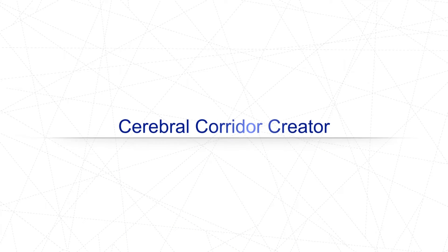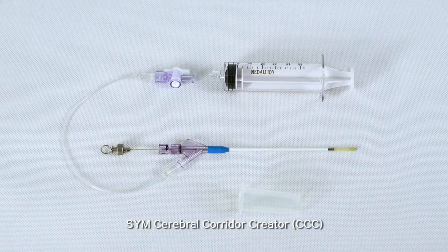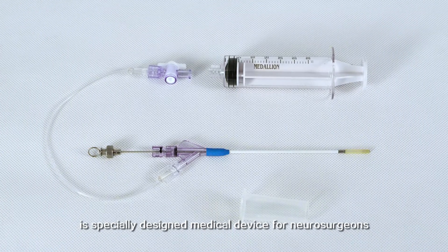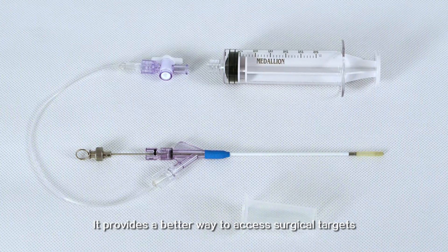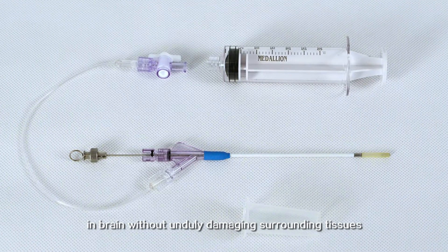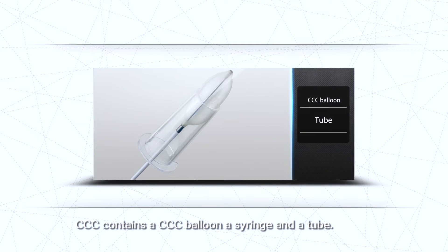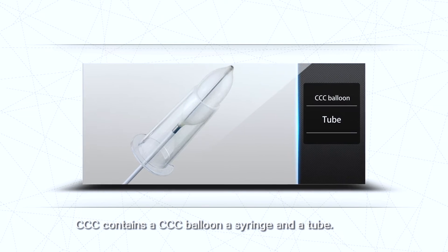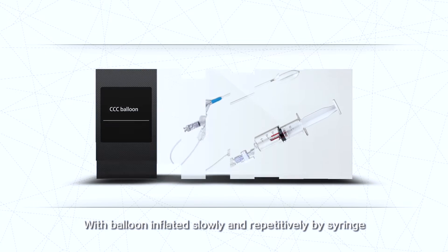The Cerebral Corridor Creator (CCC) is a specially designed medical device for neurosurgeons. It provides a better way to access surgical targets in the brain without unduly damaging surrounding tissues. CCC contains a balloon, a syringe, and a tube, with the balloon inflated slowly and repetitively by the syringe.